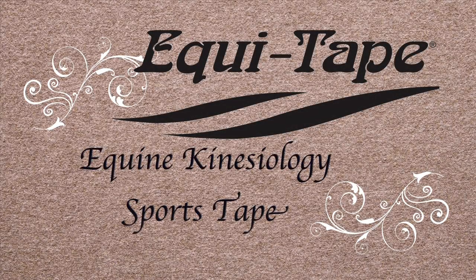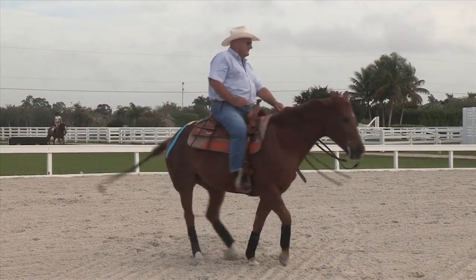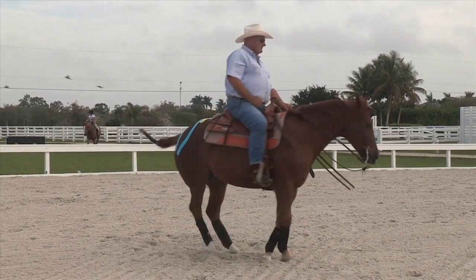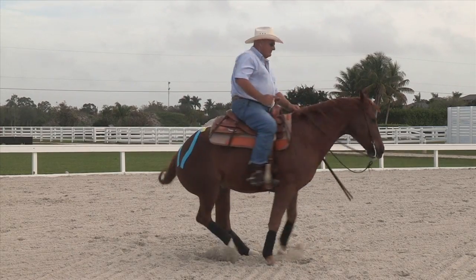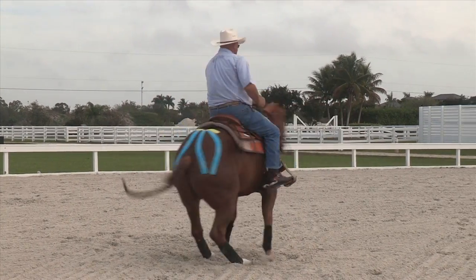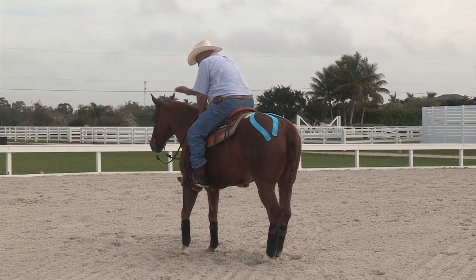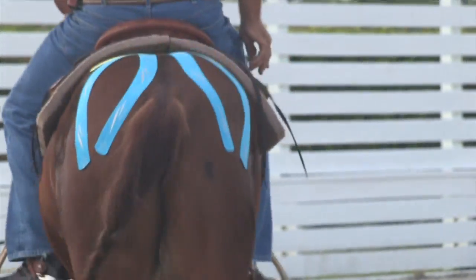EquiTape is the first elastic kinesiology therapy tape designed specifically for the equestrian community. This taping can be used for horses with sore gluteal muscles. It can be quite beneficial when worn during training to support working muscles, decrease potential soreness, improve potential training effects, and increase oxygen flow and circulation to the working muscles. EquiTape is also great for horses going back to work and in rehab.